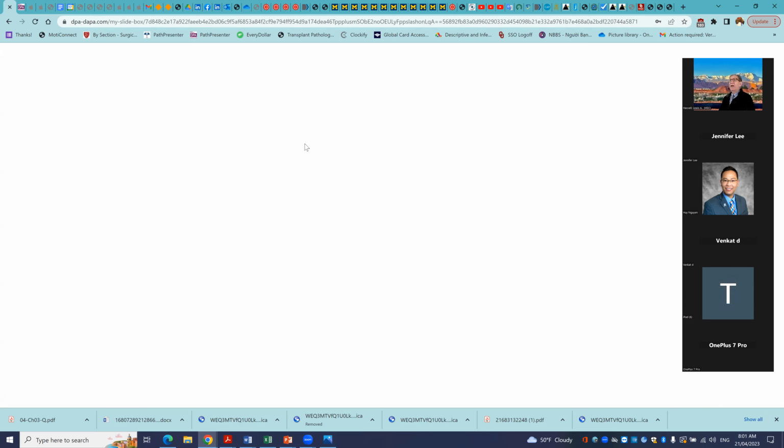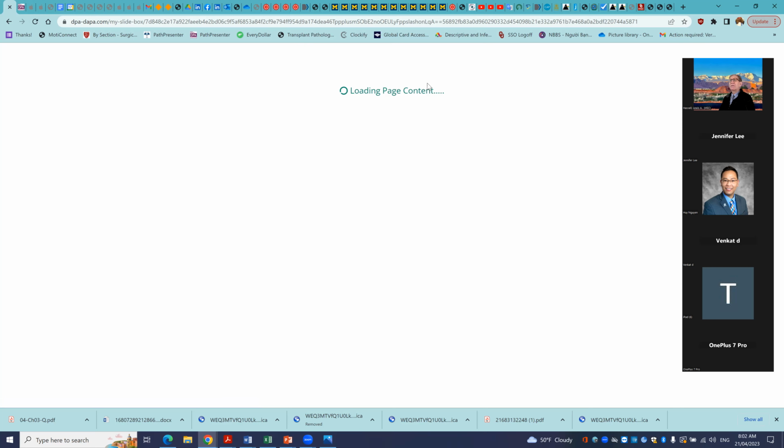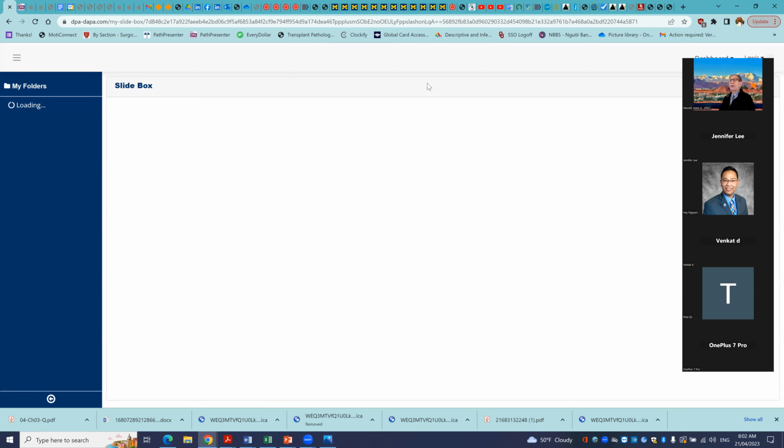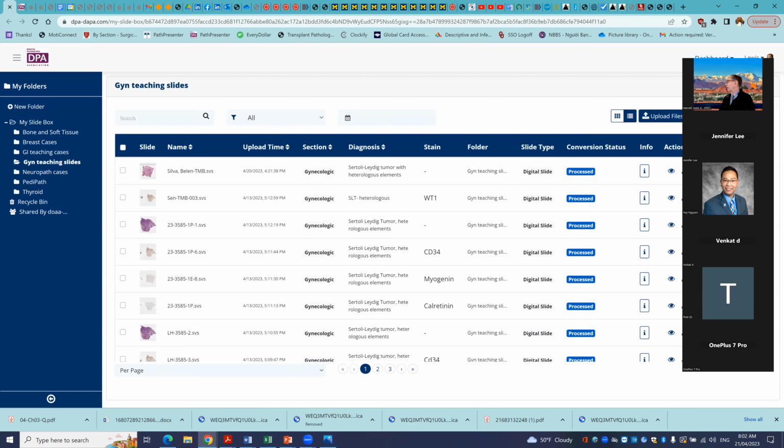So we're just about to the end here, and I apologize for those of you who just joined that you missed our discussion, but I will be posting the video later today. And these last two cases are from the DAPA site. Let's see if I can pull it up now with this open.